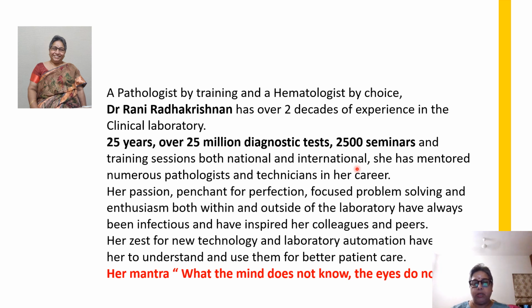In this session, I'm going to talk to you about the scatter plots, the cytograms, and the histograms that are today forming a part of every cell counter that we have in the hematology lab. Unless we understand what these convey, we've not fully understood our cell counters, and therefore we will not be in a position to really interpret the information that the cell counter gives.